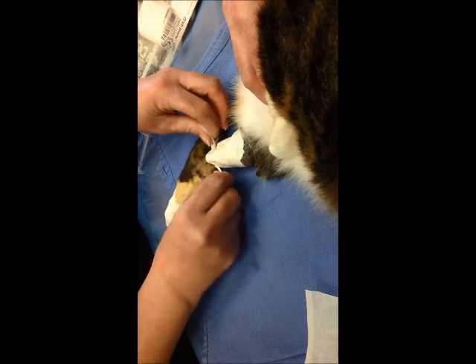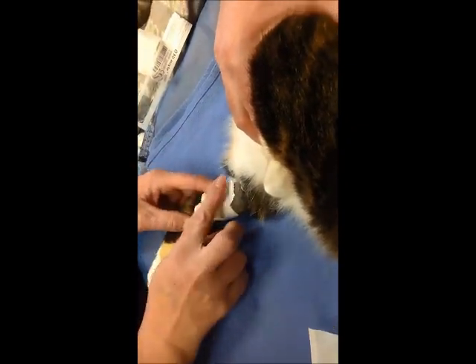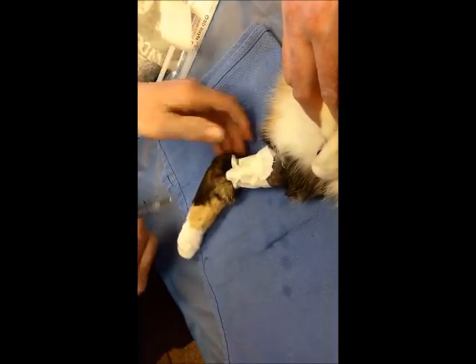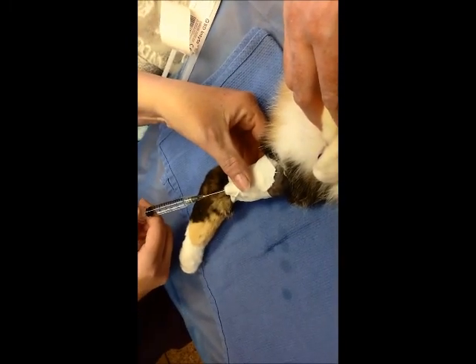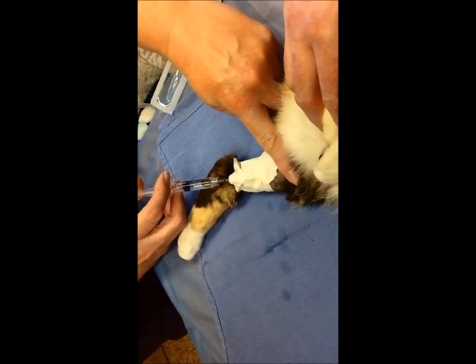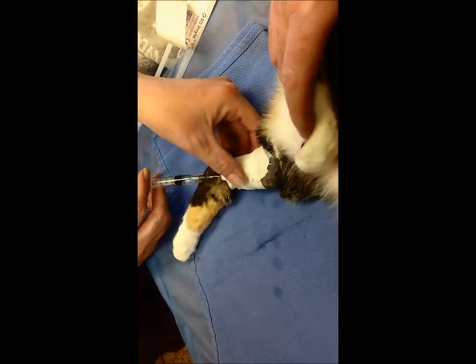Stirrup, put it around the catheter. Here. This is flush. Very good. 2 cc's added.